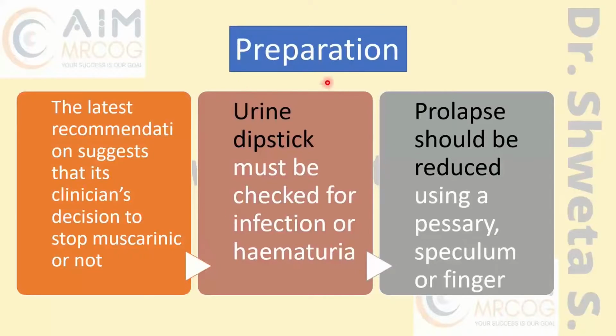Now, how will you prepare her? Can I ask you, will you give her antibiotic for preparation before cystometry? Because that is an invasive test. You can introduce infection, right? So will you be giving her prophylactic antibiotic? No, Dr. Santosh ma'am, no. So you all know that there is no role of prophylactic antibiotic in cases of cystometry. Though it is an invasive test, you are doing it in a clean atmosphere, you are doing it cleanly. So there is no need of prophylactic antibiotic.